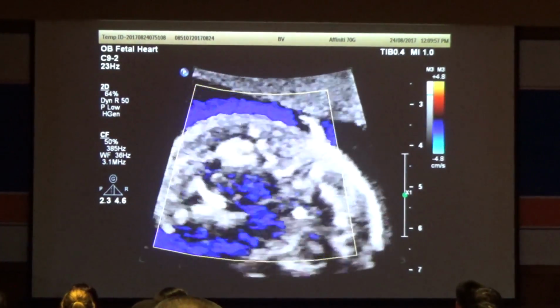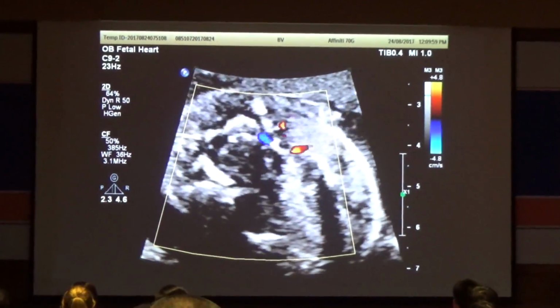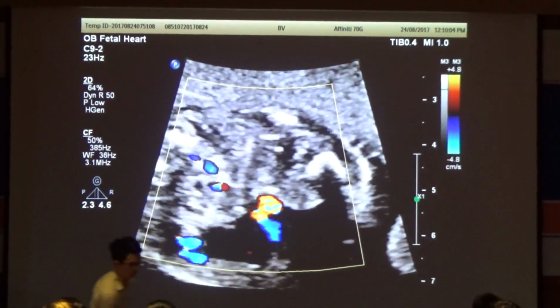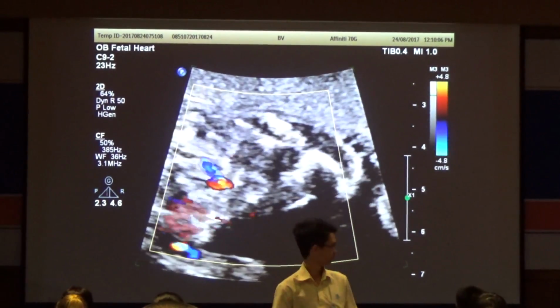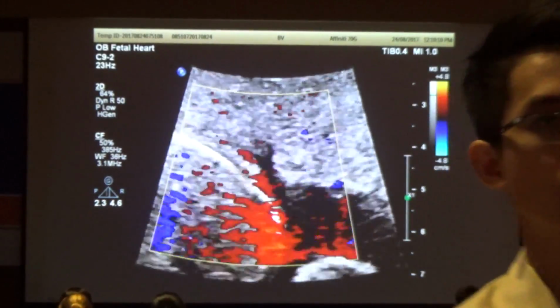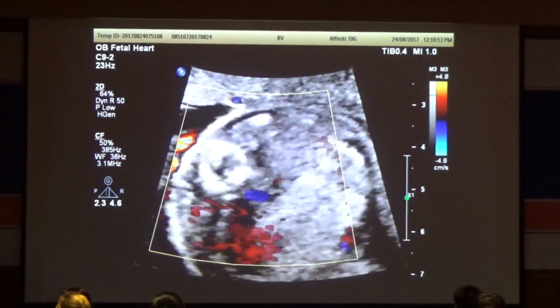We're not really interested in the head. We always do Doppler in these, even in the cardiac exam. We start doing that. We also always look at the brain. Thường thường thì chúng ta có siêu âm tim đi nữa thì chúng ta phải coi cái não bệnh nhân, bởi vì có thể có một số cái xuất hiện bất thường, chúng ta sẽ dùng Doppler.